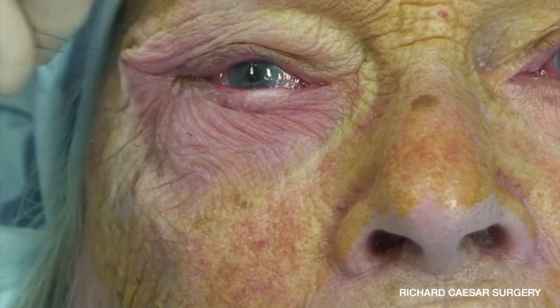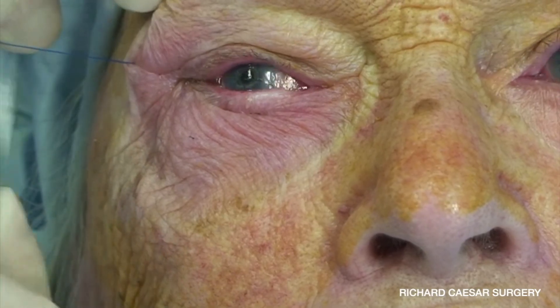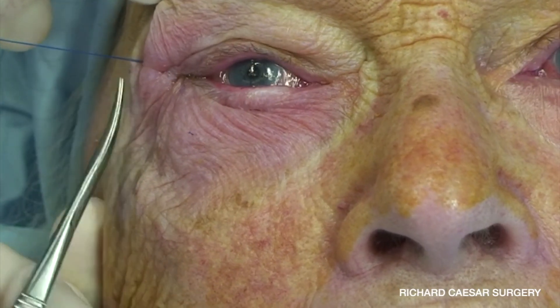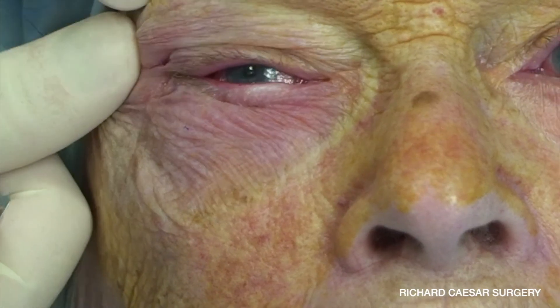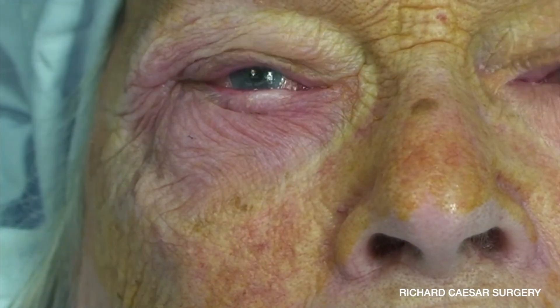That's then trimmed down, and what's really nice with this technique is that once that's done, that's the end. You don't need to place a single further suture — no skin sutures are required at all.